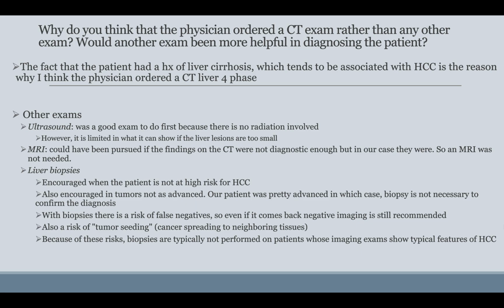And liver biopsy is also something that the physician can choose to do. It's typically encouraged when the patient is not at high risk for HCC, and it's also encouraged in tumors that are not as advanced, but our patient was pretty advanced, so the biopsy wasn't necessary to confirm the diagnosis because the CT liver 4-phase was enough to diagnose the patient.